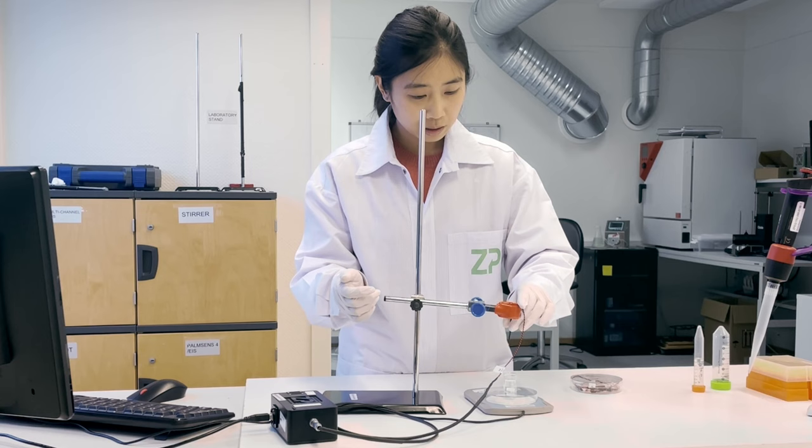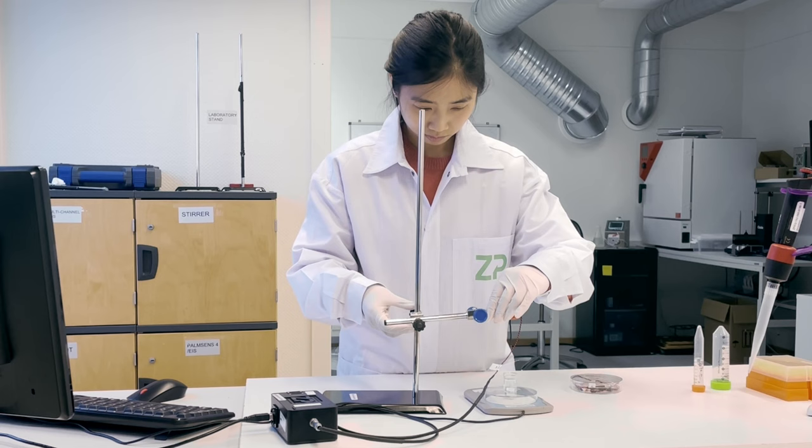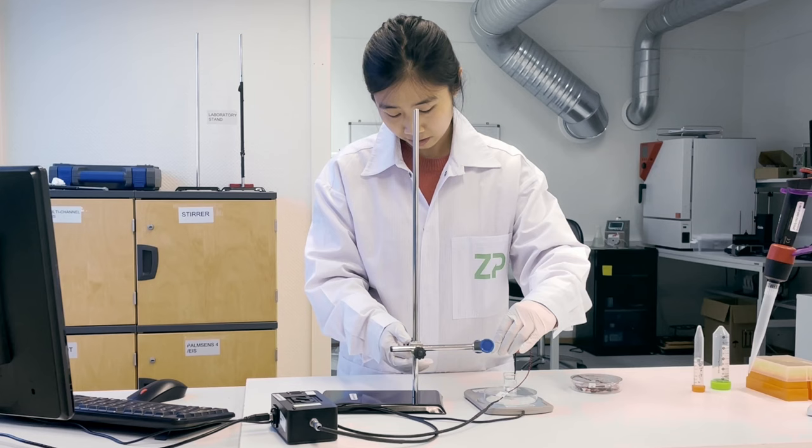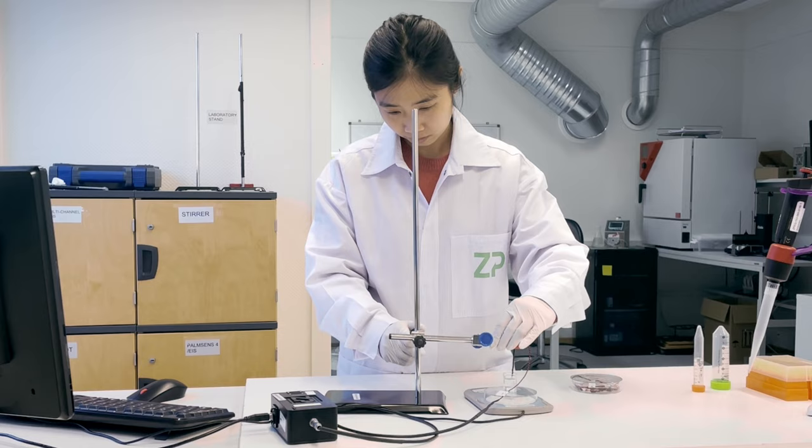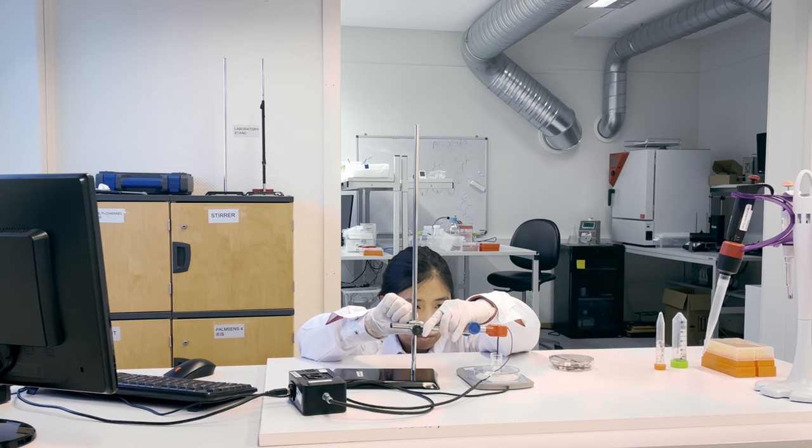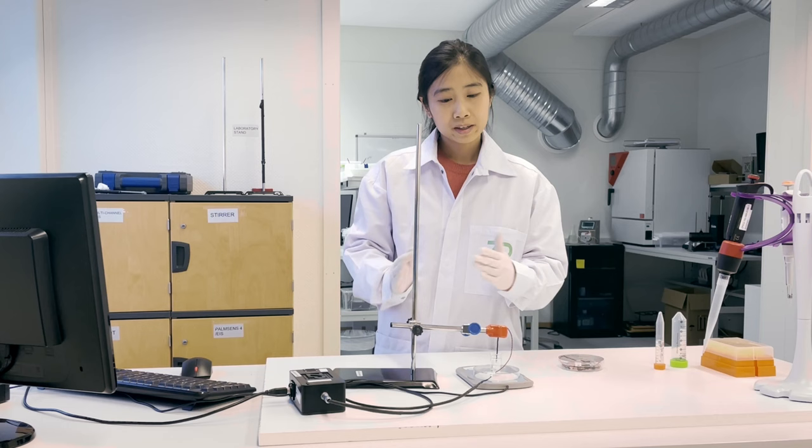Now we need to lower our wire sensor into the solution. Make sure the wire is not in contact with the magnetic stirrer, otherwise it will generate huge electronic noise. Now I can see the sensor is inside the solution but not in contact with the magnetic stirrer.